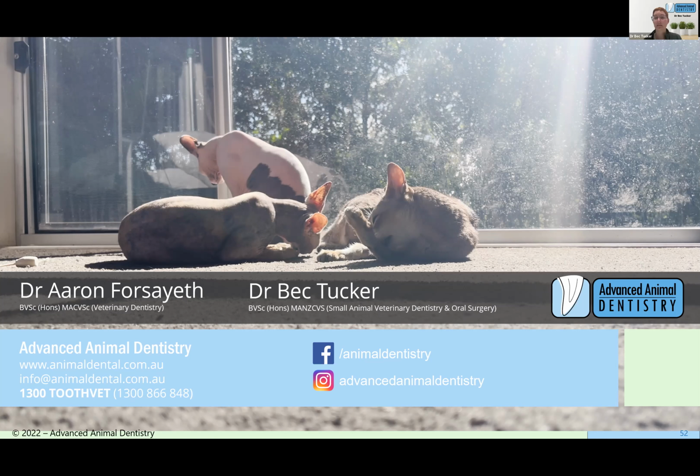Yeah, I guess that is another point: when you're moving them into sternal and dorsal, you're going to have potentially more weight coming down on the plate, with the patient almost actively closing their mouth a bit more, which is true. And interestingly as well, Beck, the techniques where they're done in sternal and in dorsal really do rely on the plate being just across the mouth at all times. Every shot is taken with that. And you're also going to get, again, more damage to the plate, more bending.